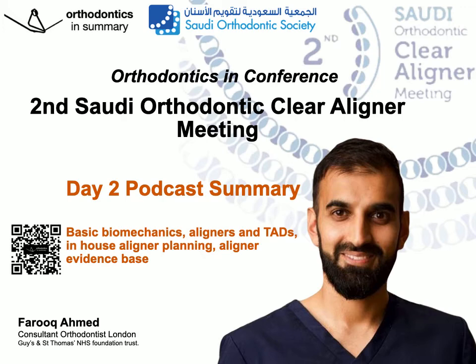So Invisalign has a product labelled Invisalign First, which allows attachments to take place on primary and secondary teeth, and they are optimized attachments. He described the key to expansion with Invisalign First is the staging approach, which allows expansion of the first permanent molars to begin with, then followed by expansion of the remaining primary teeth. He described this as a neat way to work on anchorage changes.